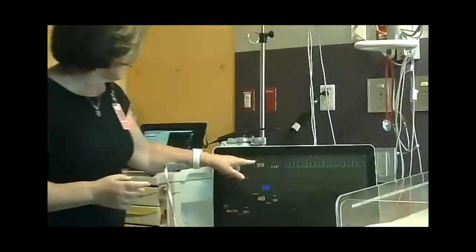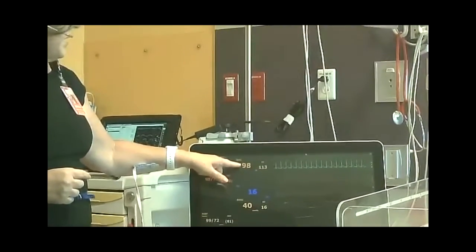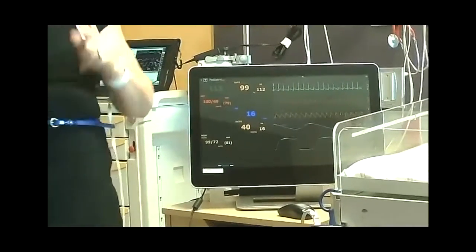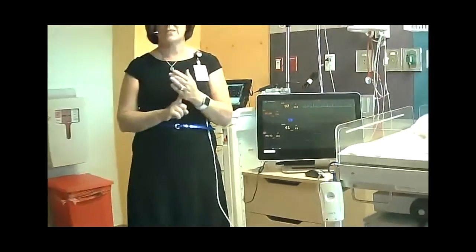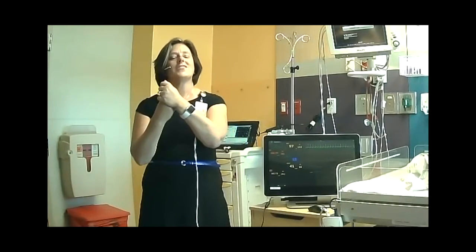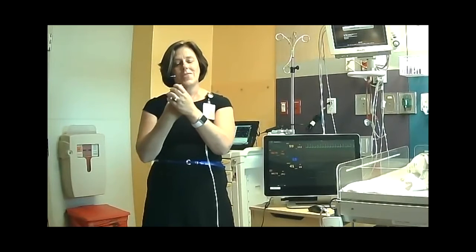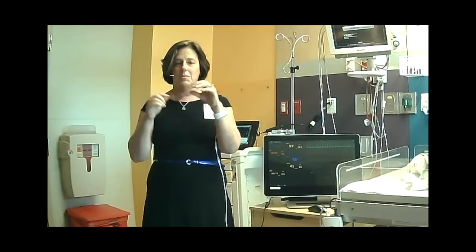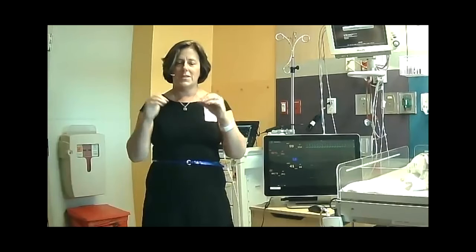One other reading on here is your SpO2, or pulse oximeter. A pulse oximeter is a little light that you wear on your finger. I know I'm probably dating myself, but if any of you saw the classic movie E.T., he had a finger that glowed, right? We always thought of that back then, well, now it's so 90s, 2000. But you might see his finger glowing. That's what we're doing, we're putting on a light. What that light reads is the amount of oxygen on the red cells, the trucks, the people delivering oxygen in the red blood cells. And it sees how many of them are carrying an oxygen molecule.